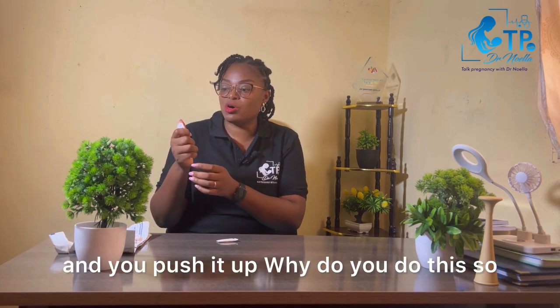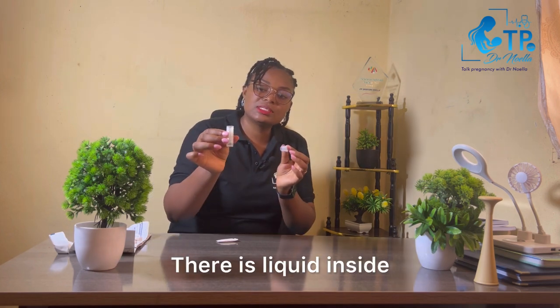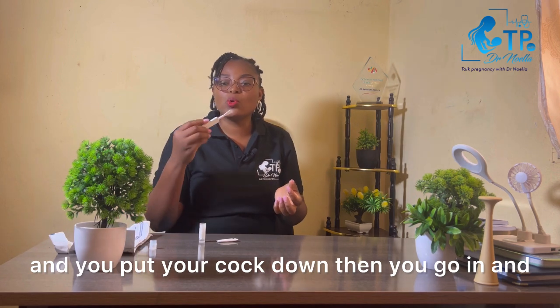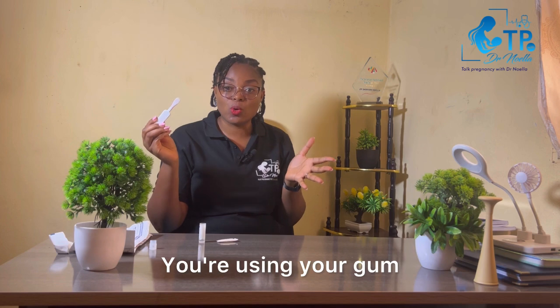To open the tube, use your thumb and push it up so that the liquid inside does not spill. Put it down on the surface. Then, with your spatula, you go to your gum — upper gum, left to right — and then lower gum, left to right — making sure you have touched all areas of your gum.